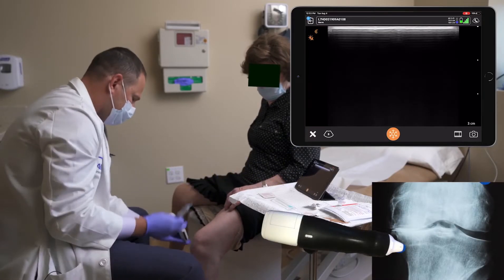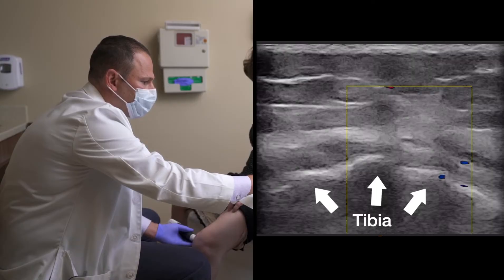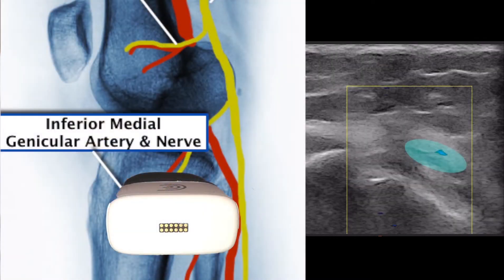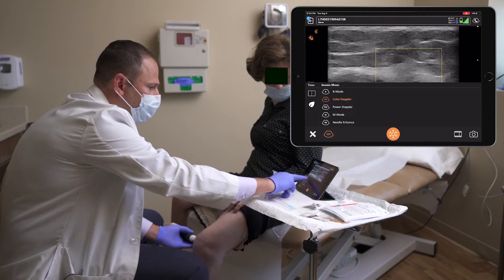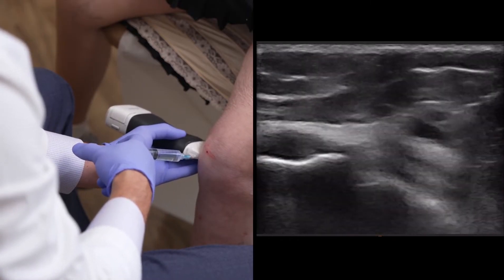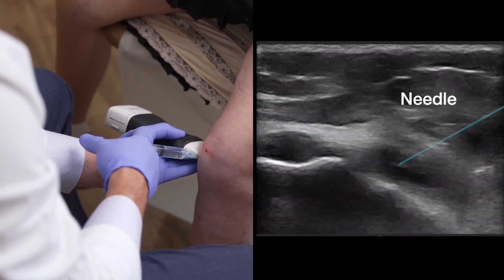Now we're going to target the inferior branch of the medial genicular nerve, going below the knee joint onto the tibia, the medial aspect. Looking for the blood vessel — it's a small nerve here and it may be difficult to find at times. It runs with a blood vessel and it's superficial to the bone. It appears that the nerve is right here. Injecting another one to two mLs around the genicular nerve in the inferior medial position.